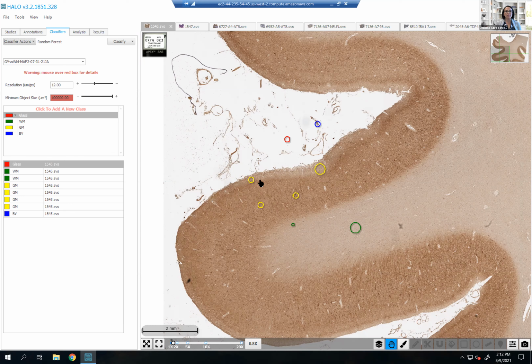One of the most difficult parts of using this tissue classifier is that you can only enter a certain amount of data. So it's good for very small data with high contrast, for example, in color.